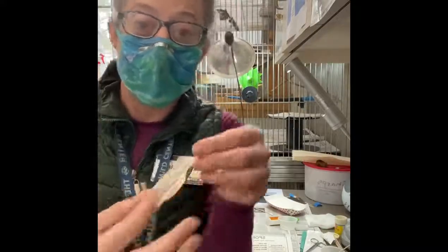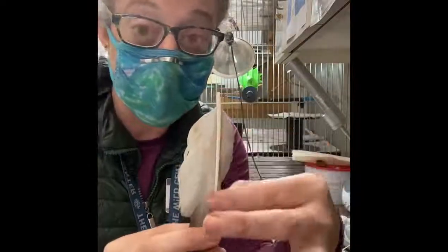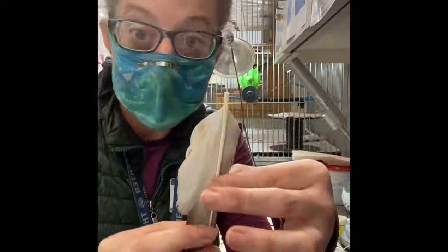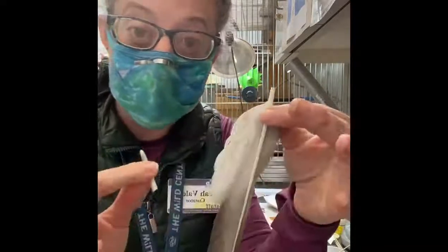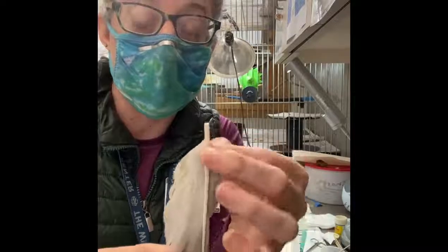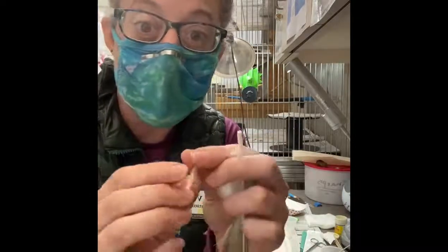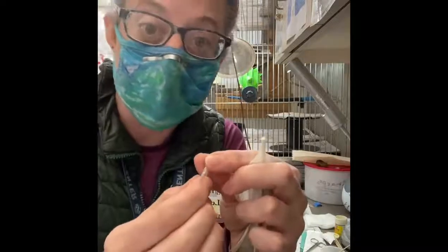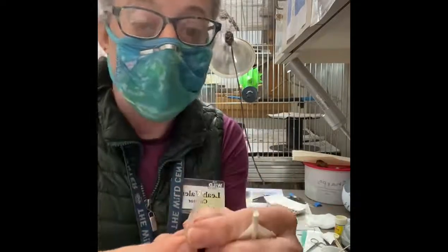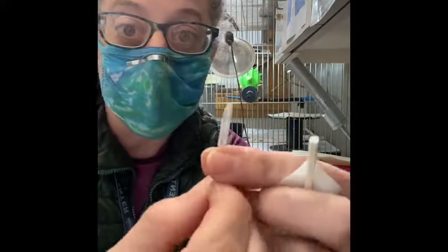The nice thing about a feather is it is material we can use for certain things. When you look at a feather, this is the shaft in the middle. As a feather is first growing, there's a vein in here, and then once the feather is fully out, the vein dies back. But it leaves this shaft that is hollow, and it's also pretty strong — it's the same material as fingernails or beaks. So what we're going to do is use a piece of shaft that I've already cut.